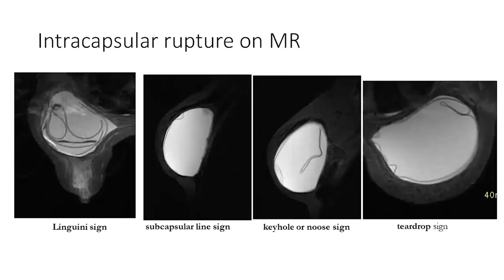Here are some examples of intracapsular rupture on MRI. This is a classic linguine sign, where we see these strips of the intracapsular polymer floating like linguine floating in water on the MRI, and these tend to settle dependently. This is the subcapsular line sign — we have the dark T1 fibrous capsule and the lighter black silicone polymer capsule, and we can see silicone on both sides of it. We can also see it smaller and more subtle down here.